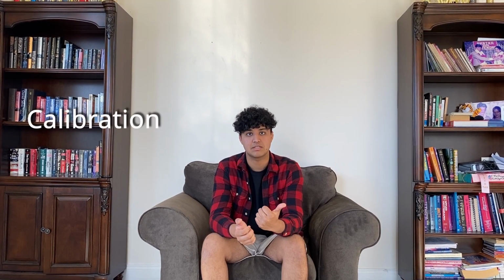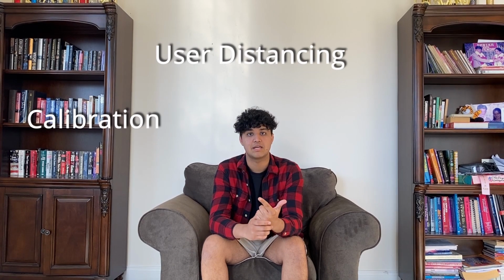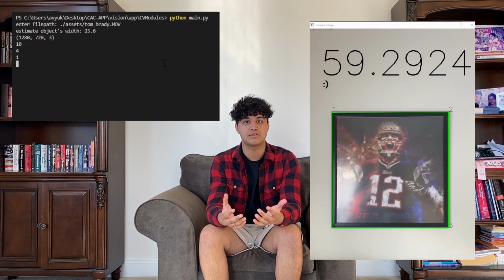Our program has 3 simple steps: calibration, user distancing, and blur adjustment. Calibration only has to be done once, and this is to allow our program to run on any phone with any camera on any object. To do this, the user takes a still video of a known object from a known distance. For distancing, the app accurately tells the user where to move for the diagnosis. Then, the user will adjust the blur values on the phone screen so it matches what they see in real life.